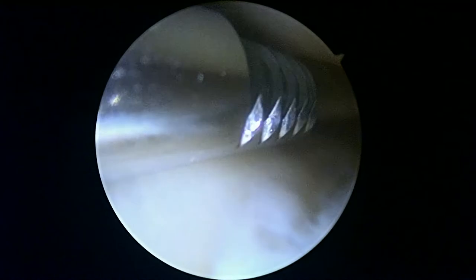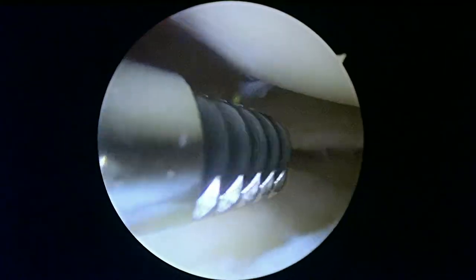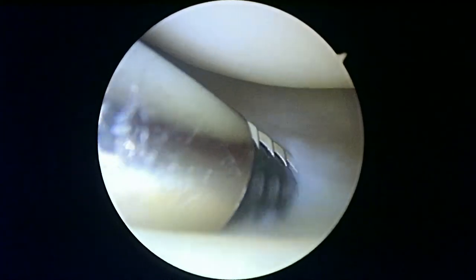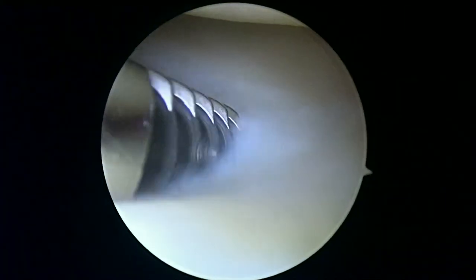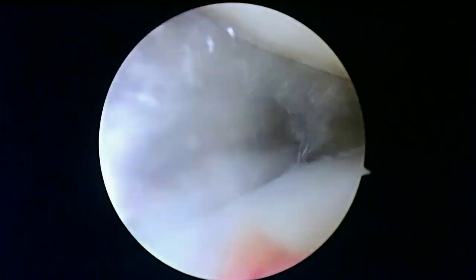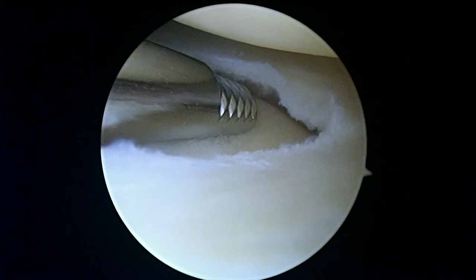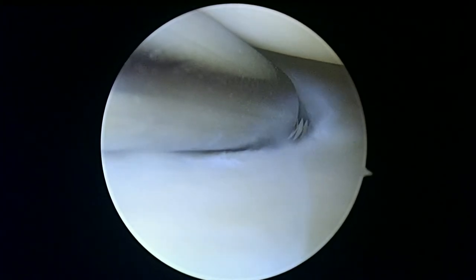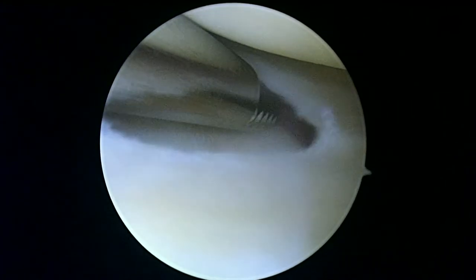Now we're in the lateral compartment on the left knee. There's a meniscal tear coming through right in the body — that's what we're working on right now. The articular surfaces look like they're in a little bit better shape than the lateral compartment on the right knee. These knees are almost mirror images: the lateral side is worse on the right knee, and the medial side is worse on the left knee.